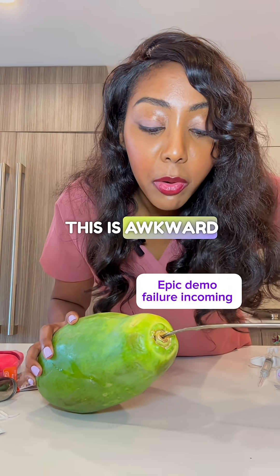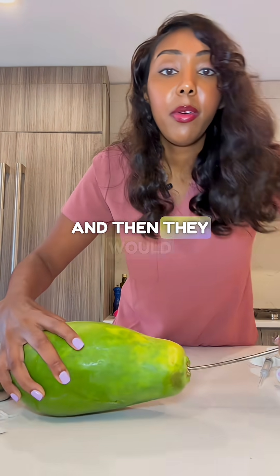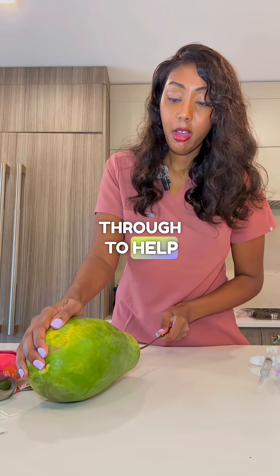It doesn't look like this — this is awkward because it's the papaya, not a real person. And then they would move this instrument through to help.